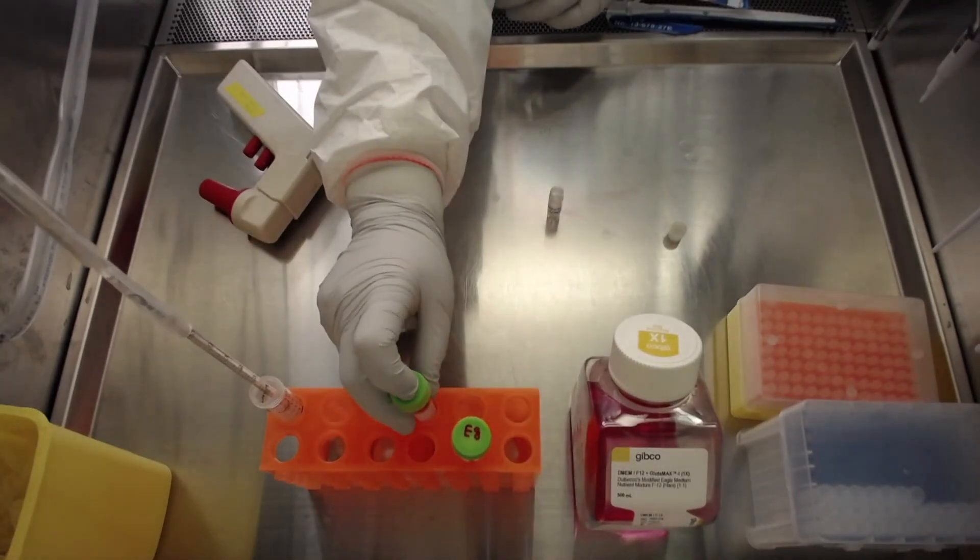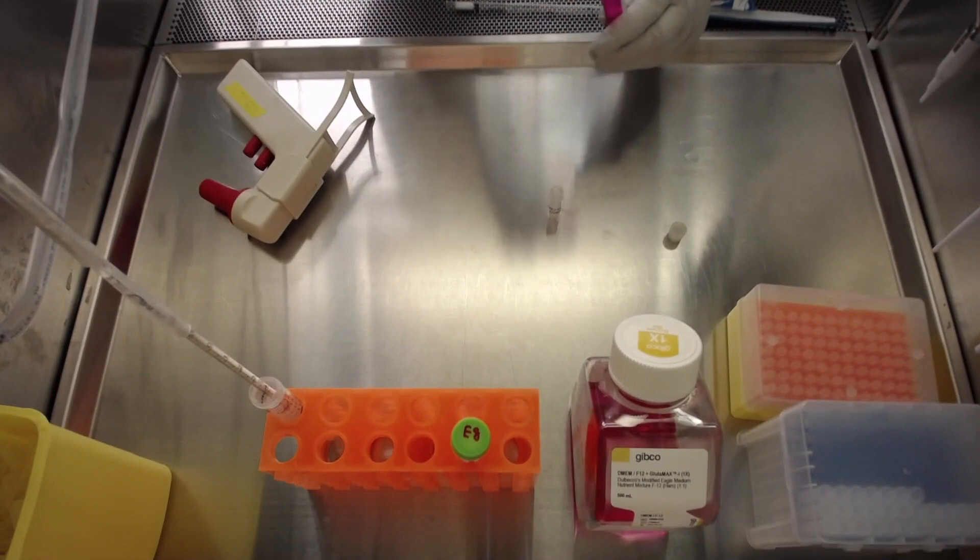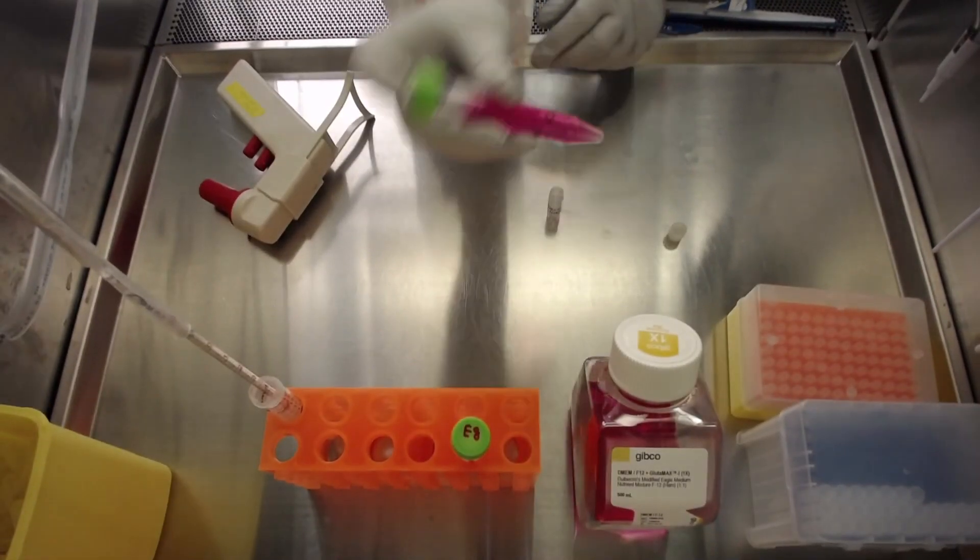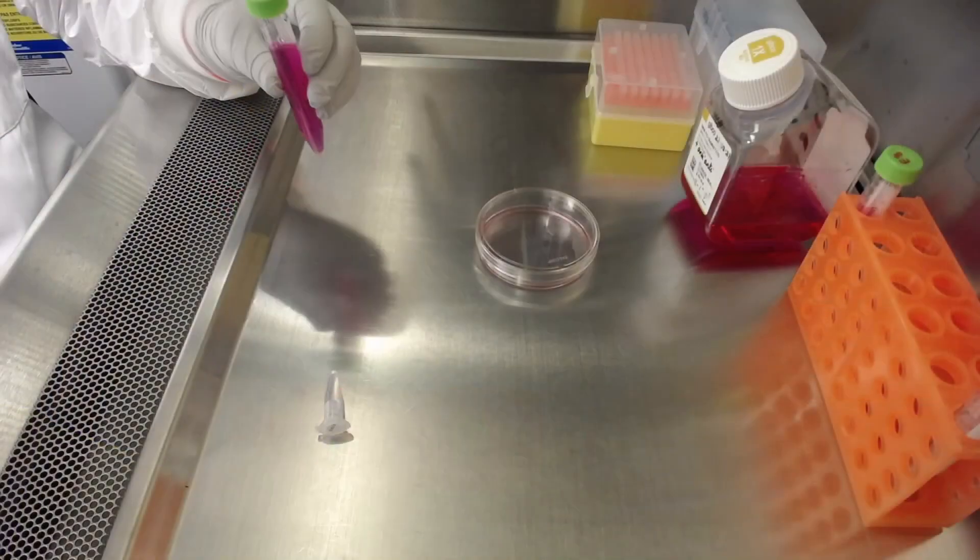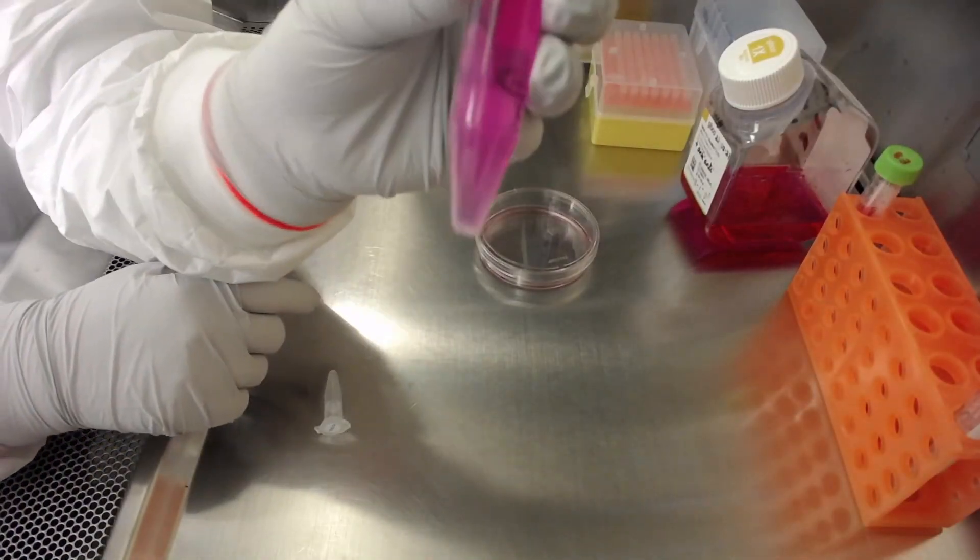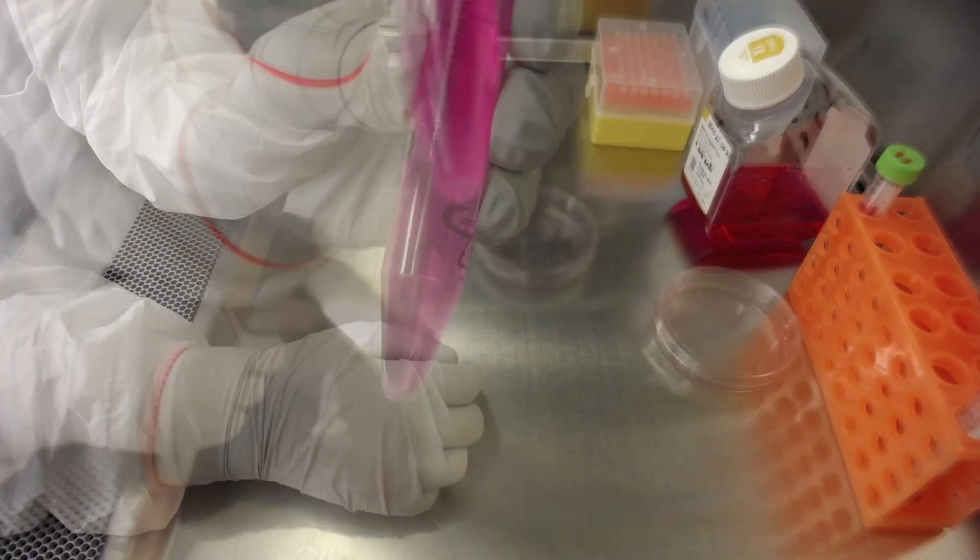Close the tube and gently homogenize the cell suspension by inverting the tube a few times. Centrifuge the cells for three minutes at 1200 rpm.